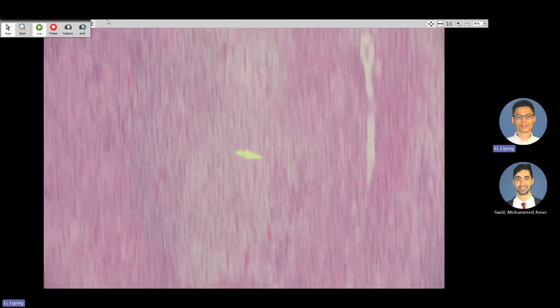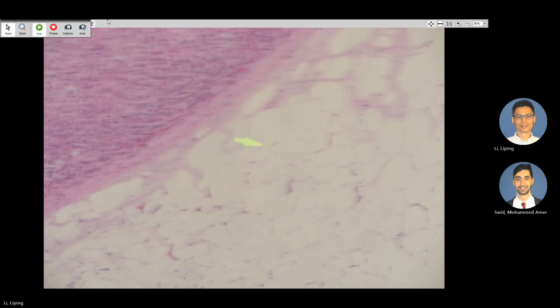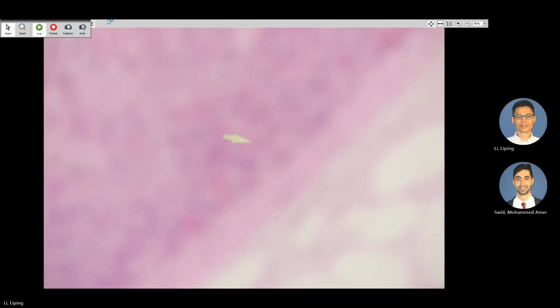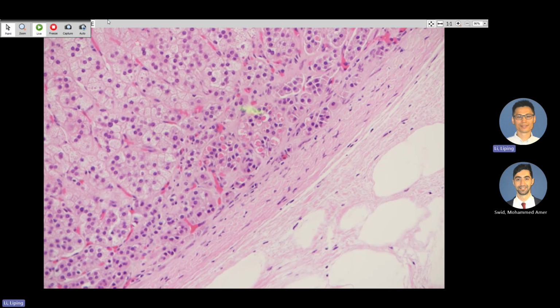And other than that, I would like to show you one. This lamellar cytoplasmic inclusion is a spironolactone body. Let's go to high power. You can see the lamellae growing. So this patient had an aldosterone secreting adenoma and then got some treatment.